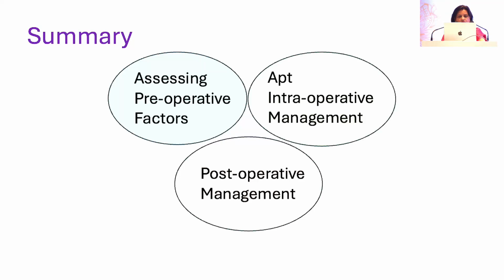So to summarize, one has to assess the pre-op factors and do appropriate intraoperative management, and of course in the post-op period also see that the cornea functions well.